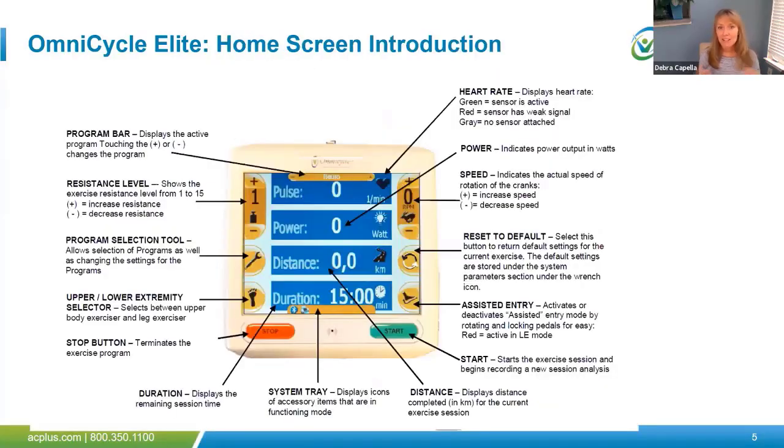Okay, so let's take a closer look at that screen. Now, there is a lot going on this slide. I'm going to take my time and go through it so you get a feel for all of the different ways that we can be modifying or adjusting as indicated. We're going to go into more depth into some of these options as we move further through the demonstration, but just to orient you to what's happening on our home screen.